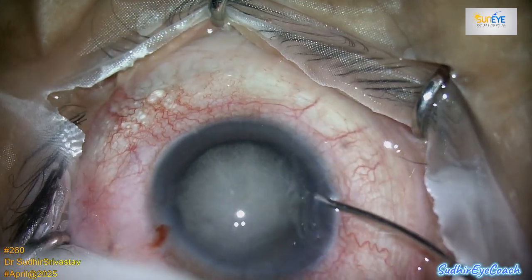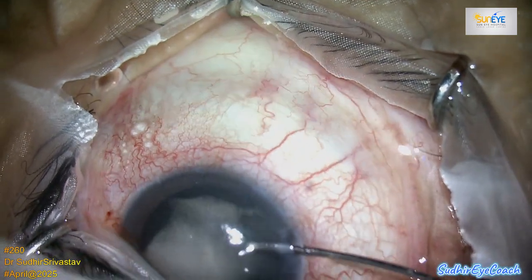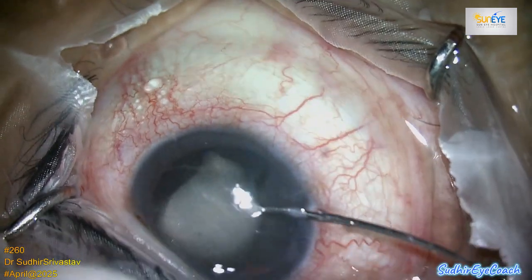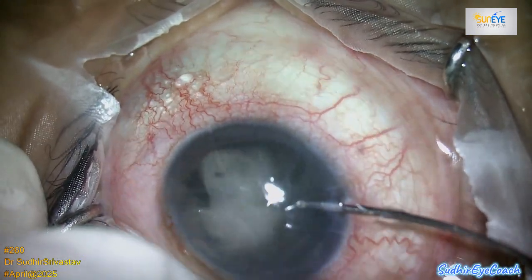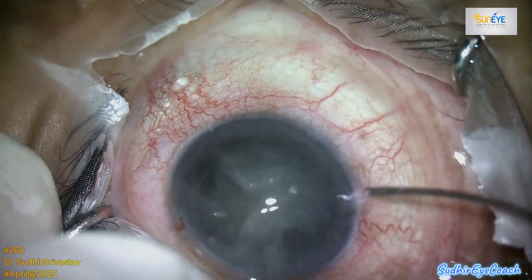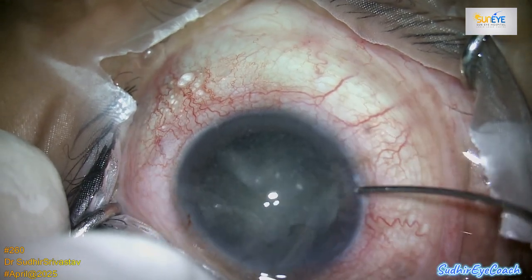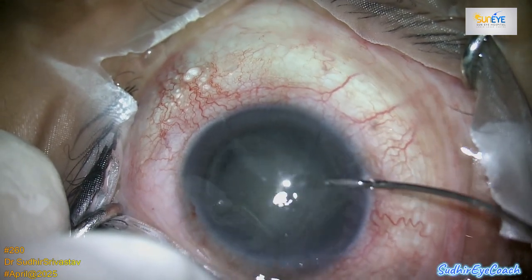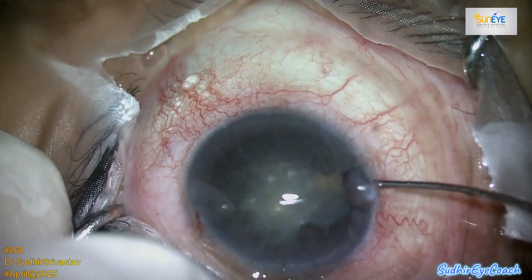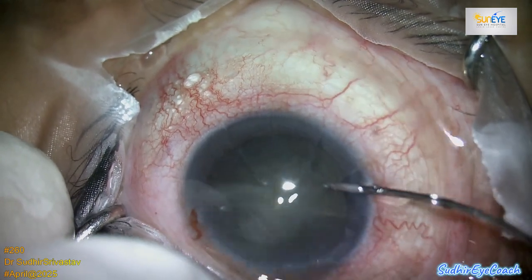To begin with, I created the side port incisions and then carefully removed the silicone oil from the anterior chamber. Since the radial keratotomy scars were minimal and there was sufficient space available between them, I opted for the corneal approach, performing both side ports and the main clear corneal incisions through the cornea.